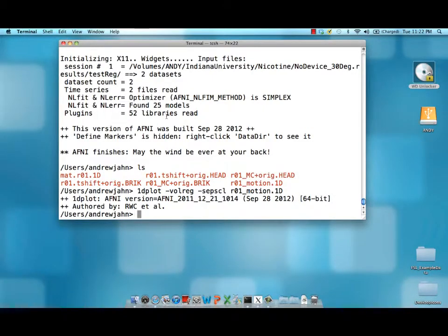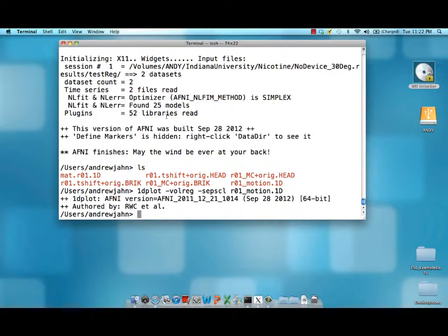That's volume registration and motion correction with AFNI. And in the next tutorial, or a future tutorial, we'll be talking about how to integrate that with 3dAllineate when you warp your functional images to a standardized space.